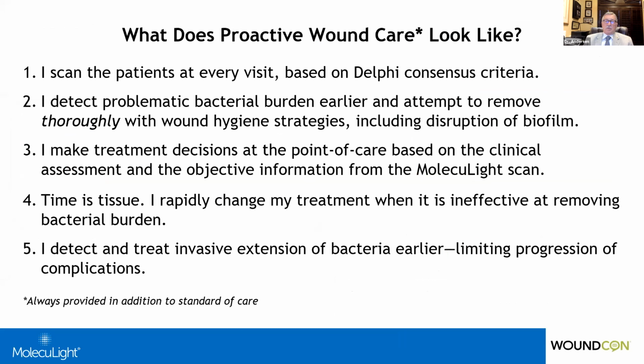So what does this really look like from a clinical perspective? Patients are scanned with every visit if they meet the criteria as recently published in our paper. That allows us to identify the bacteria very early before it's clinically evident, and then through cleansing that wound and debridement, we can remove that bacterial burden.